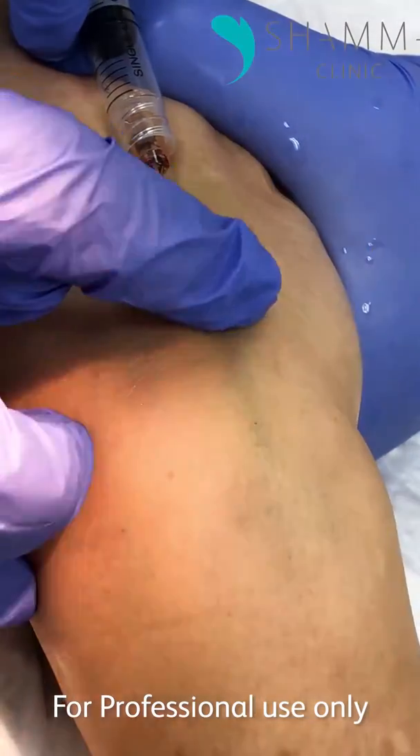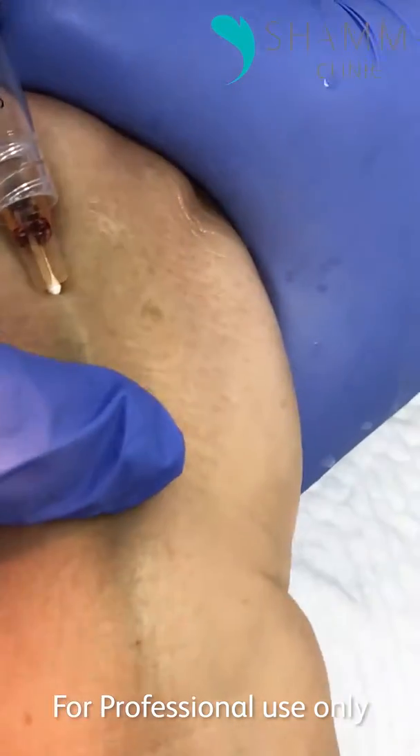More — bravo, more, bravo! See, it's filling. This is all trapped blood.